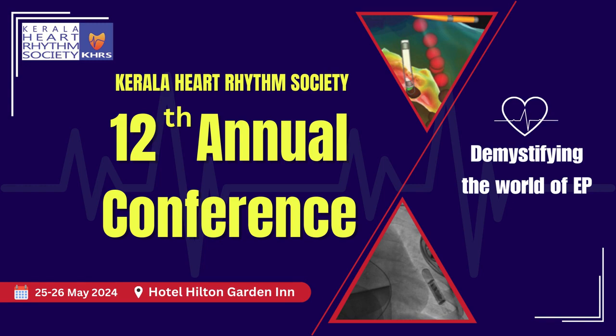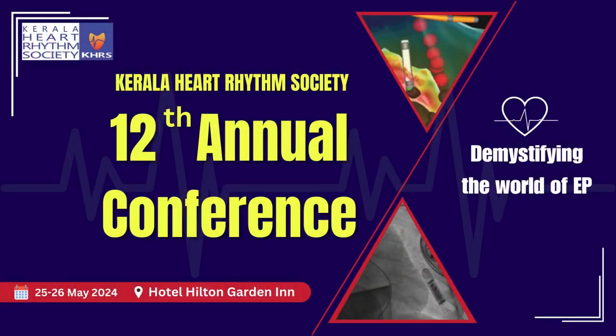Arun, beautiful demonstration. I have 2 questions. One, in the TEE, if we are seeing some clots in the LA, we have to wait. Yes. For any form of these procedures, if you have a left atrial appendage clot, it's an absolute contraindication. You anticoagulate and ensure that all the clot has gone before you instrument. If during the procedure you find that a clot is forming, as one of the foreign operators showed yesterday, you might take a sheath in and suck out the thrombus. But if you find the thrombus upfront, better not to go into the LA, because a procedural stroke would be catastrophic. This is a preventive procedure.